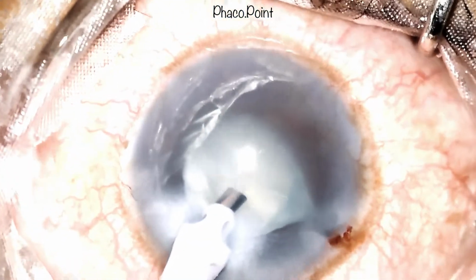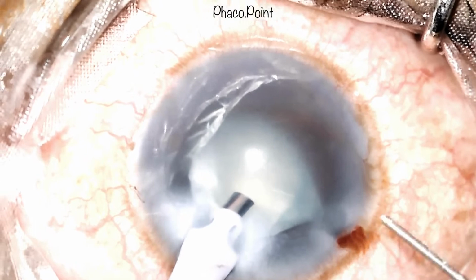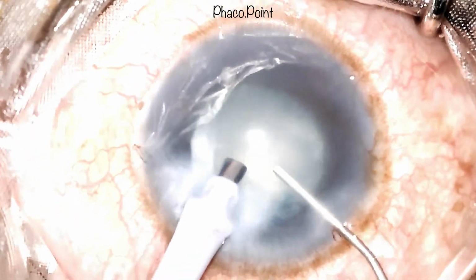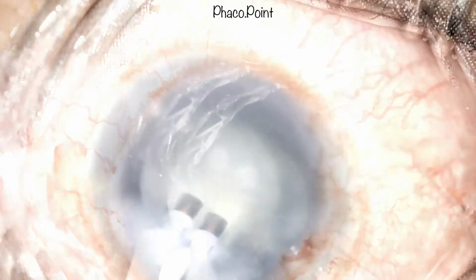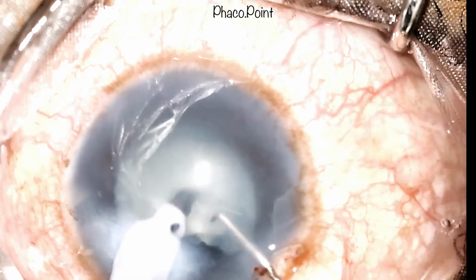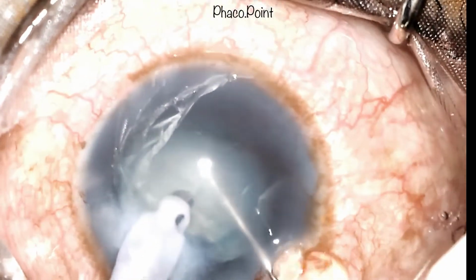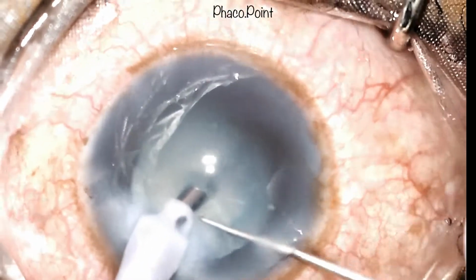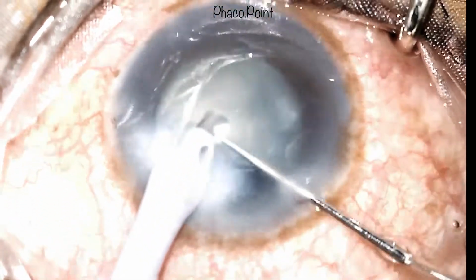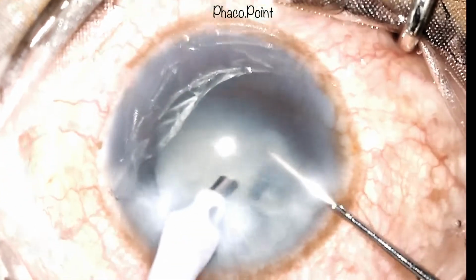As the second instrument is being withdrawn to perform a viscofluid exchange, there seems to be a tendency to an iris prolapse. The iris that is prolapsing is very gently repositioned as shown. The surgeon then continues with the phacoemulsification procedure. In the manner demonstrated here, the nucleus is downsized and each of the fragments are emulsified in the phacosafe zone, that is, in the pupillary plane.